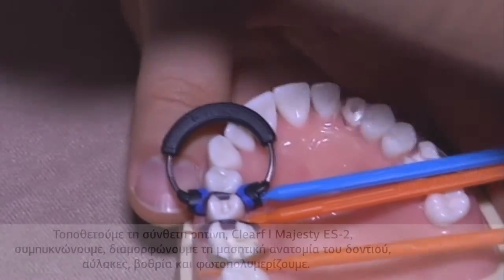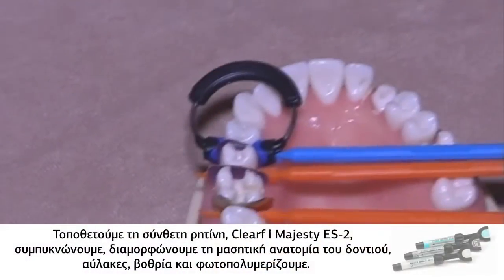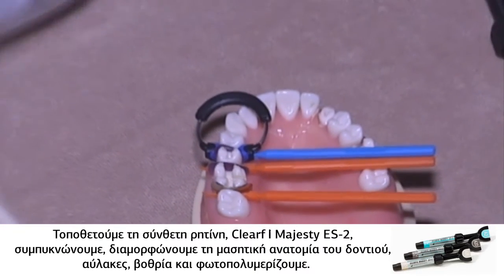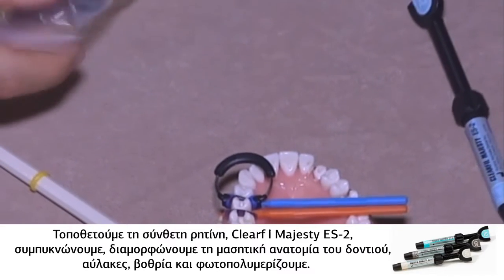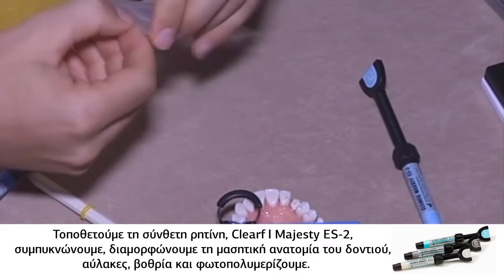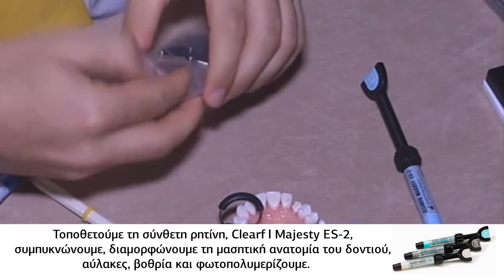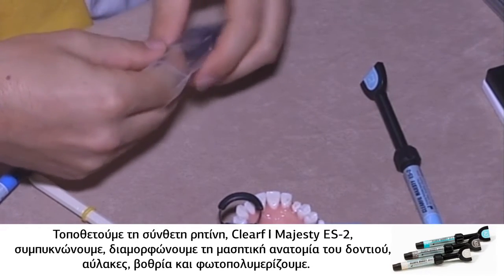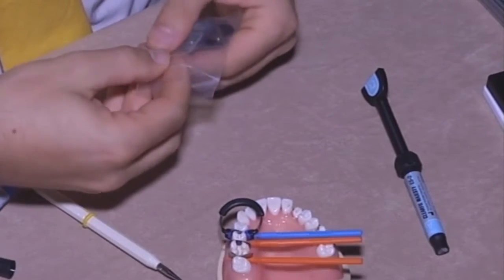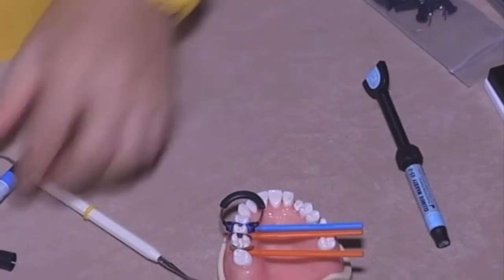And once you light cure, before removing the interproximal matrix, I always suggest to place a thin layer of flowable composite. Flowable composite on the dentin cavity gives you several advantages.